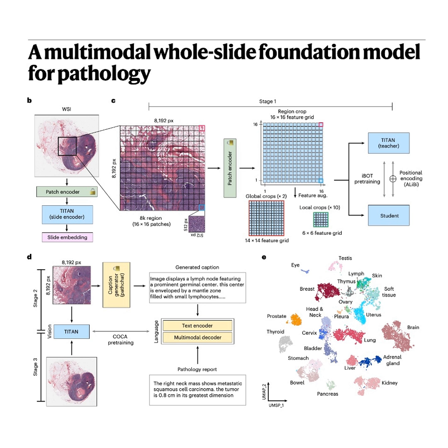So if we just step back and look at the big picture, Titan's three-stage approach, starting with this massive vision encoding, then using AI-generated text for that fine-grained teaching, and finishing with clinical report alignment. This has successfully created the most robust and versatile pathology embeddings we've seen to date. And the best part is the scalability. The framework is just inherently designed to ingest more WSIs, more clinical reports, and crucially, more of those detailed synthetic captions from tools like PathChat. The model's performance is only going to climb. Which means it can offer immediate clinical benefit in those low data scenarios, starting right now.